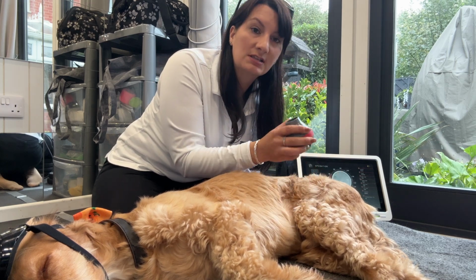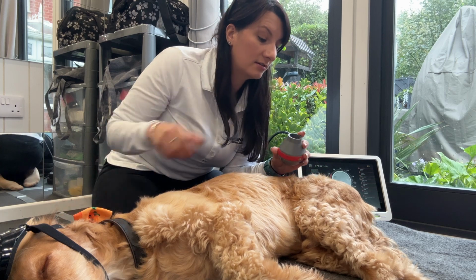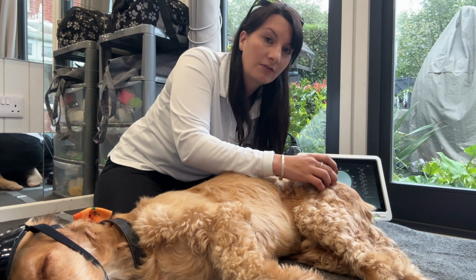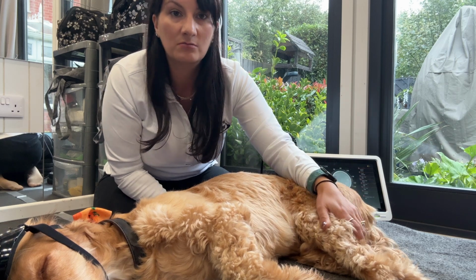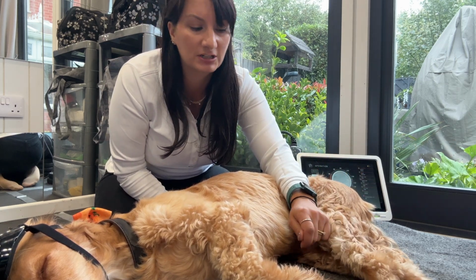Am I using contact? Am I using off contact? And then am I going to scan up and down the tissues, kind of crossing over? Are you pinpointing? But again, it tends to be more scanning methods for covering larger tissue areas.